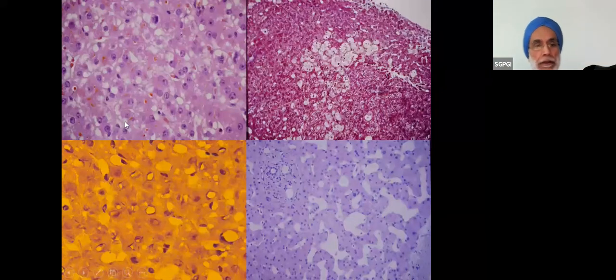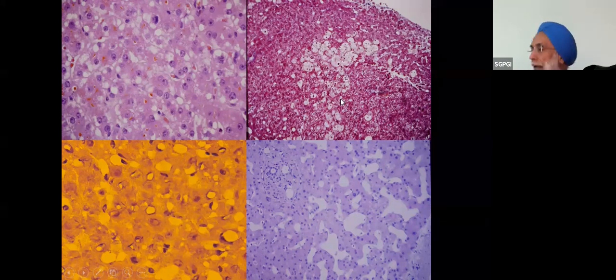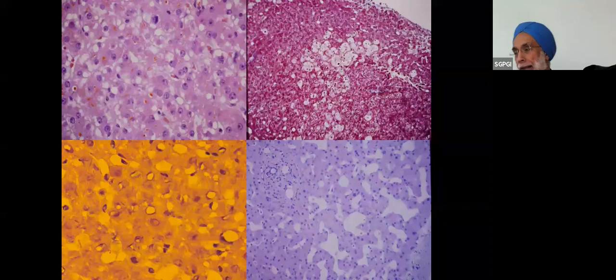So some examples. These are macrovesicular globules. A caveat is that if a liver biopsy is exposed to saline, you can get swelling of the hepatocytes. They can look very pale, as you can see here. So if you are in the position of doing frozen sections, you should be present at the time a biopsy is done. It should not sit either on a gauze and dry up, nor should it sit in a container with saline for a long time. So we are there when they give us the biopsy, and we freeze it and read it right away.